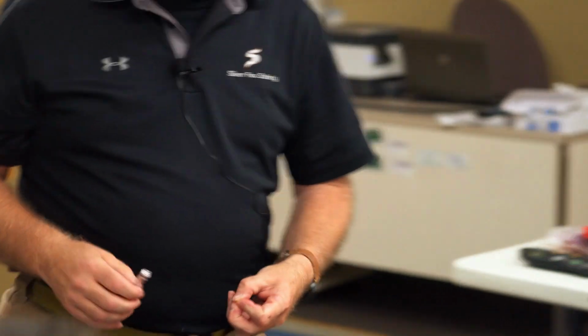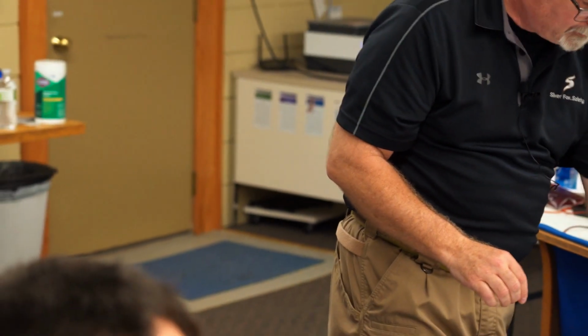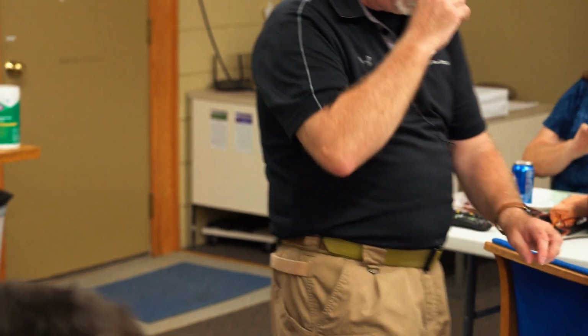If you miss, you can't keep the same needle and keep trying. You try it once, and if you miss, because we've introduced some other stuff, we'll stop, re-clean, and then redo. That's why there's three needles, for multiple attempts of each side. Don't do it the first time, just start all over.